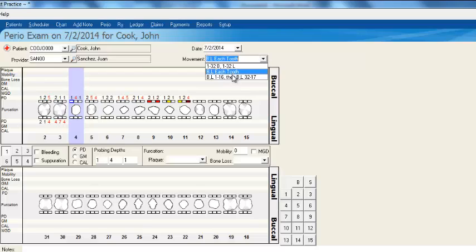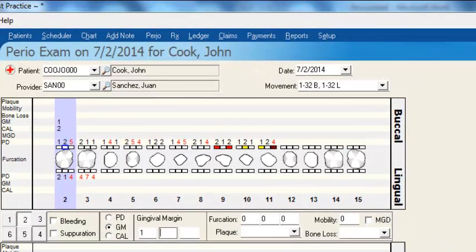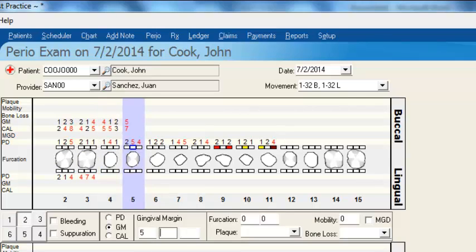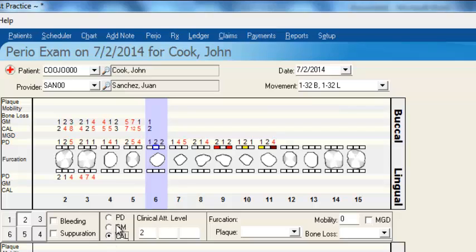You have various measurements you can choose from. You can also record gingival margins, using the keypad or the on-screen keyboard to enter that information. Then you have your clinical attachment level, which is calculated by adding your probing depth and your gingival margins together — so by entering your gingival margins, it automatically calculates the clinical attachment level.